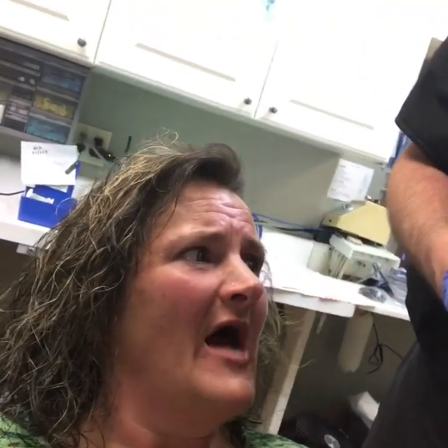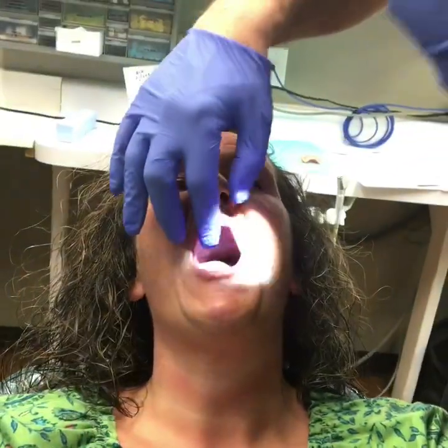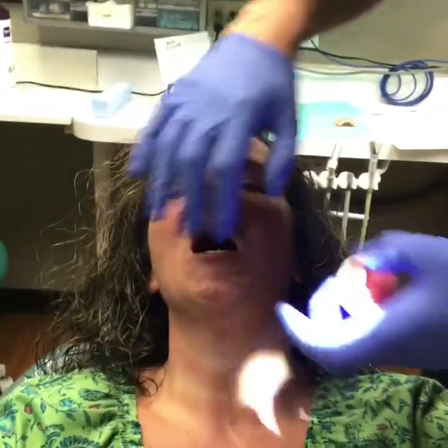Really soft. I would never use toothpaste because it's so abrasive. Correct, because of the pumice. Right. These are in wax, you remember? I need to take the healing caps out. She's going to do that. Okay. Britt, would you take the healing caps out for me, sweetie?